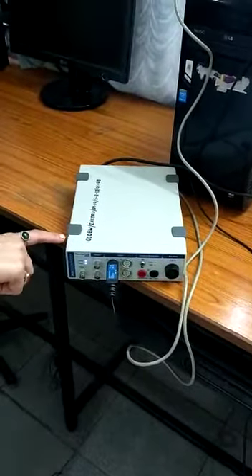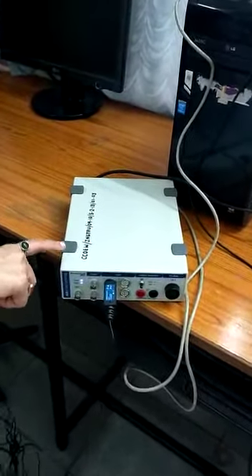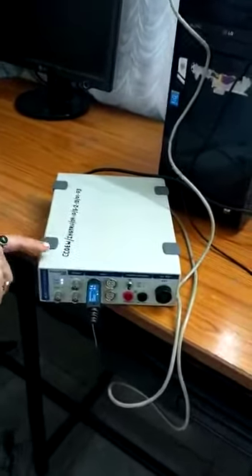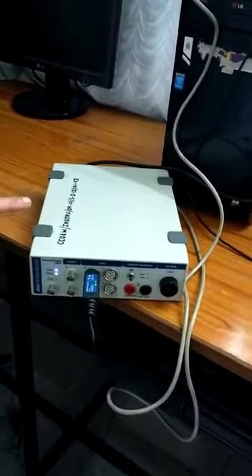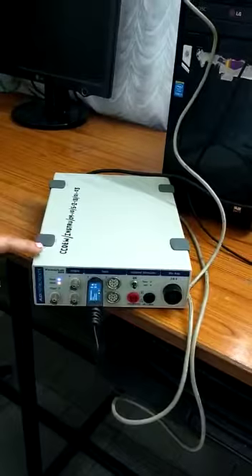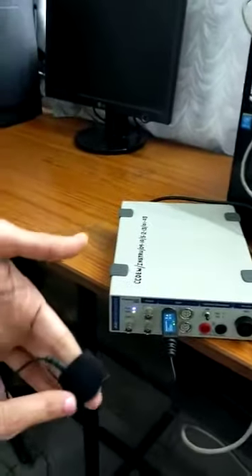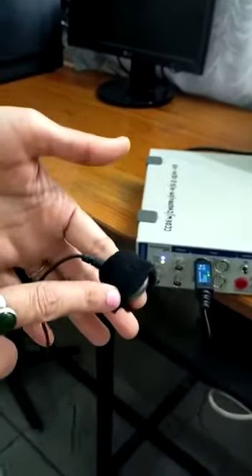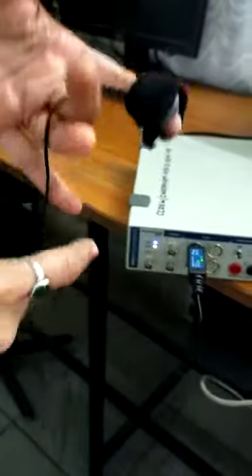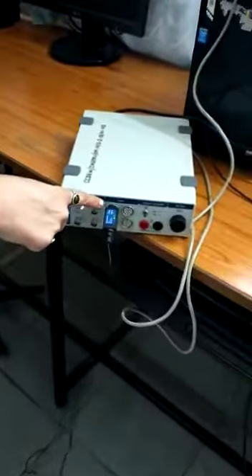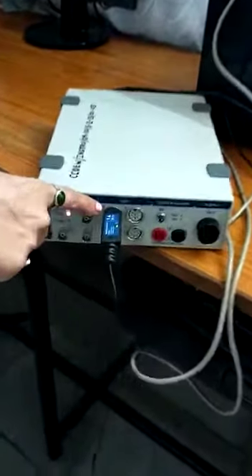This is pulse measurement using AD instrument. The sensor is a pulse sensor connected to channel 1.